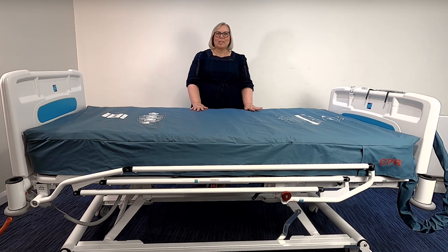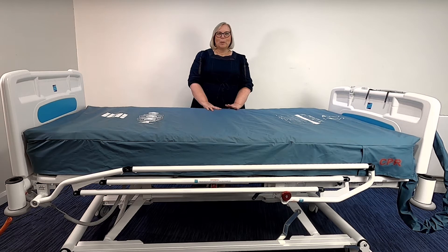The Apollo Mattress System is a full replacement system intended for use in an acute hospital setting on a general or intensive care ward. It can also be used in long-term care facilities where medical care is provided. It is the responsibility of the carer to carry out the necessary risk assessments to ensure product compatibility but also the safety of the patient.